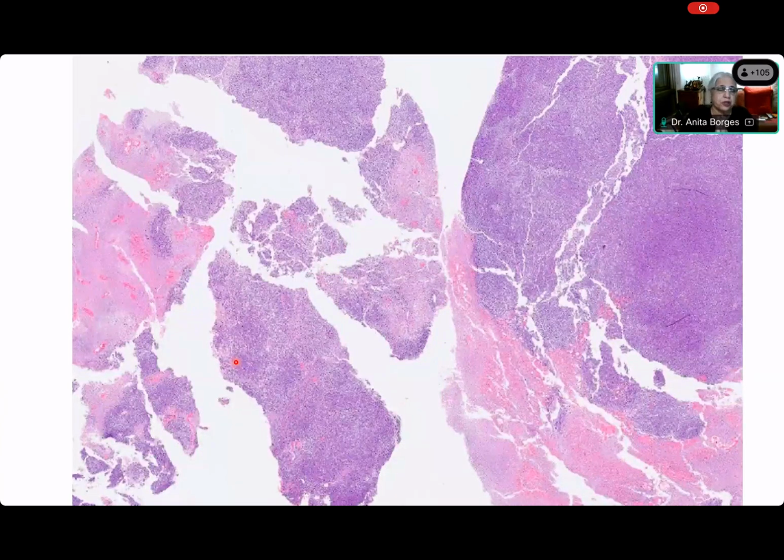And this is it. Now that you did the last case, maybe you can do the last two cases. Elsa, tell me, what is different between the last two cases and this? This is also extremely cellular. Ma'am, these are not arising in fascicles. What is it that is different under low power? That should have hit you straight away. Come on, Priya, are you there? Necrosis. Yes, she said it. It's necrosis. This is a necrotic tumor. It's very cellular, but it is necrotic.